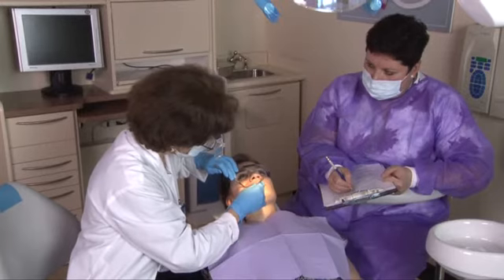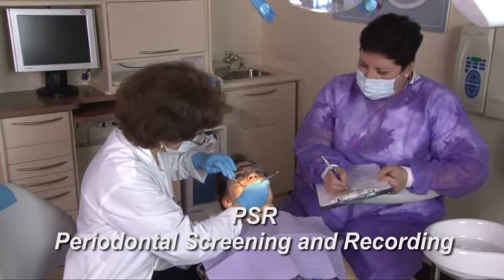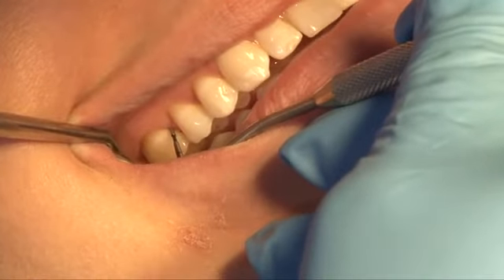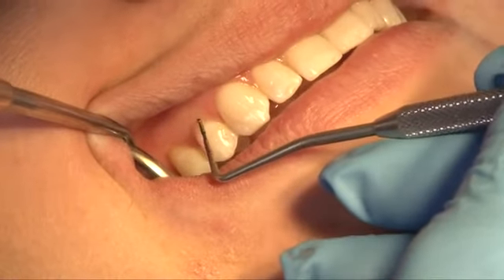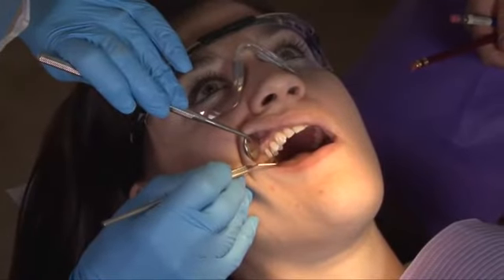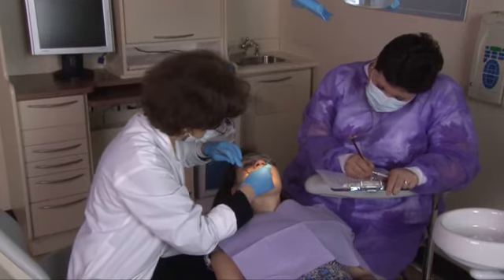In addition, during maintenance appointments, a shorter screening method called PSR, which stands for Periodontal Screening and Recording, can be performed as an initial step. This is completed with a special probe. When a measurement deeper than 5 millimeters is recorded, a comprehensive periodontal evaluation is required. Periodontal evaluations are an important part in the overall dental management of patients' dental needs. These examinations must be thorough in order to monitor and maintain the patient's periodontal health.